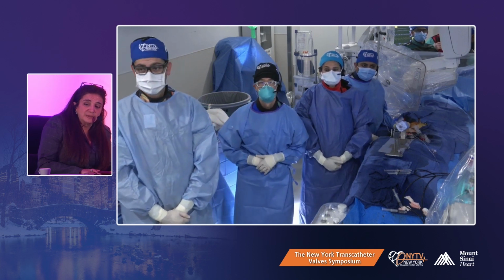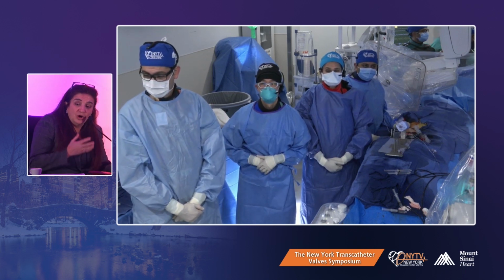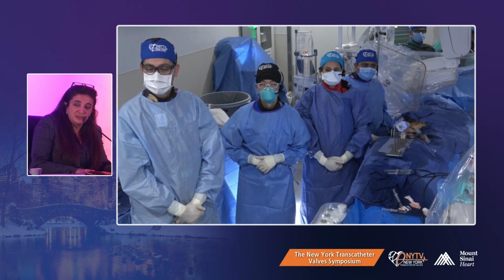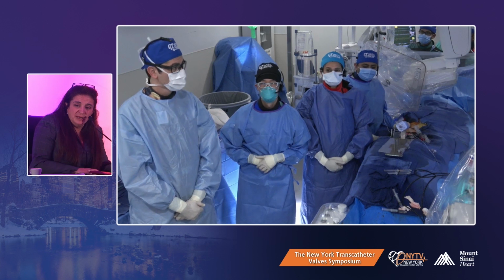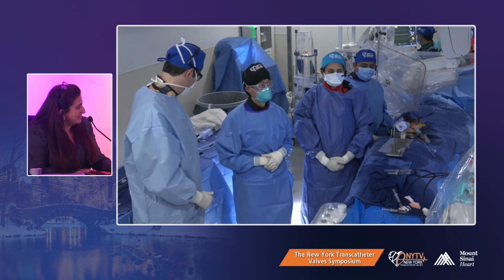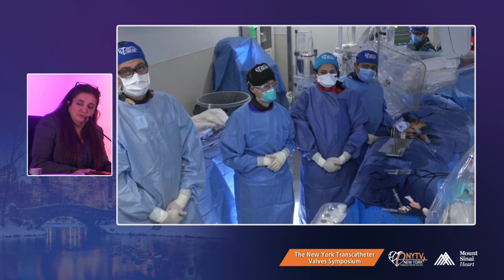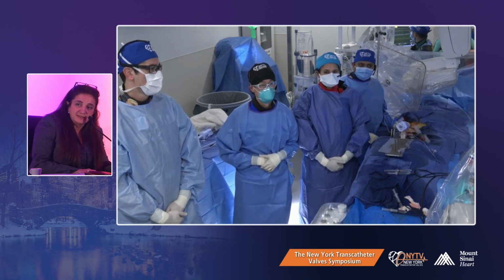A MitraClip that now you just treated this functional MR patient with almost obliteration of the entire mitral regurgitation jet, the V wave going away and the pressure improving. And then lastly, the bicuspid or pseudo-bicuspid valve work that you did, really incredible. Four amazing cases for the New York Transcatheter Valve.